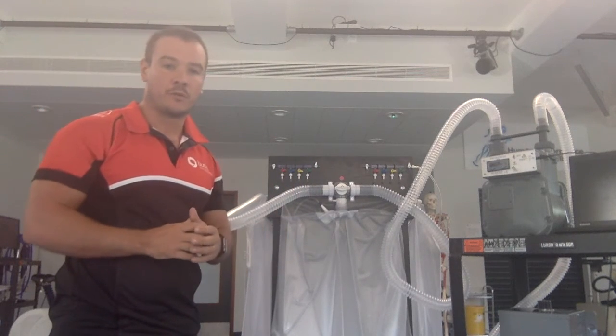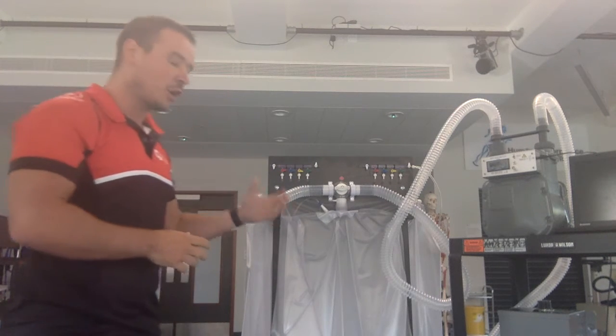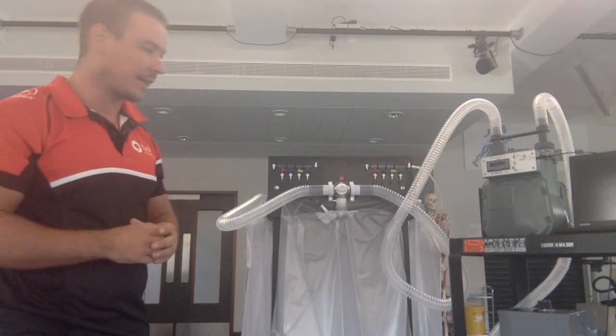If I want to empty all four bags, I can do this without switching the vacuum pump on and off each time — just open and close each bag as they empty.